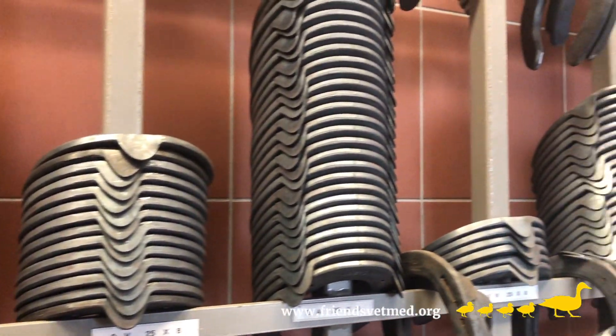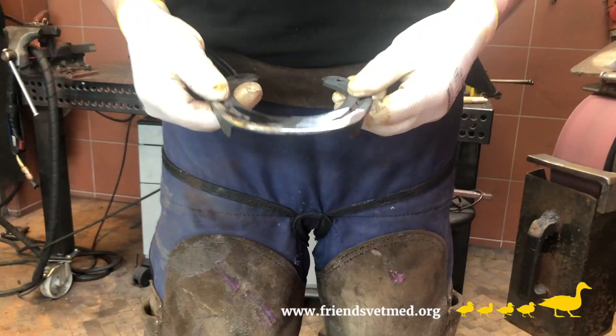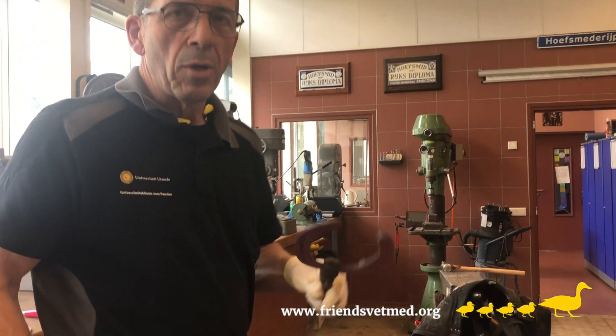Traditional horseshoes are heavy, they might be slippery, and they don't provide any cushioning of the feet.